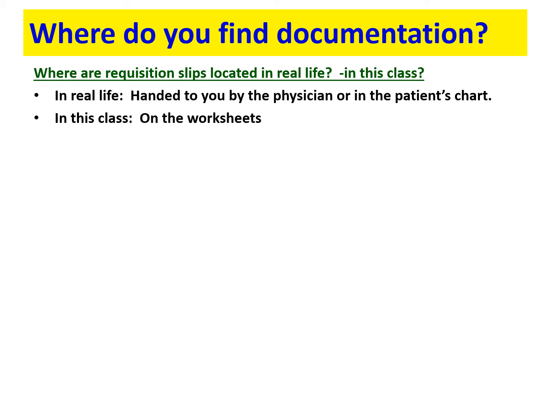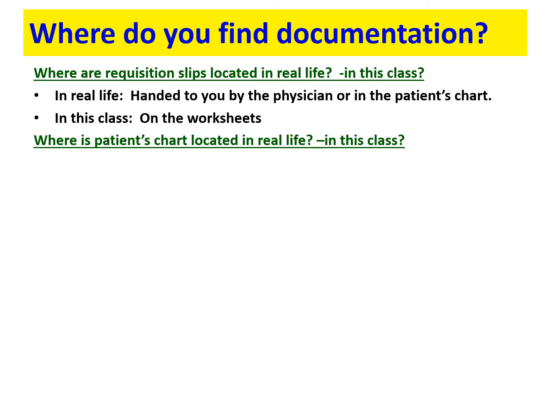We know that in the classroom, our worksheets have our requisition forms in there, as well as our dummy charts, our dummy patient logs, and our dummy QC logs. Guys, make sure you're taking your packets out that we're working on in lab, face-to-face, out at home, and make sure you're getting familiar with it. You're seeing what we're doing next. There's a lot of useful information in there, and I've told y'all, you don't want to just check those boxes. You actually want to read this stuff. It helps you learn, okay?